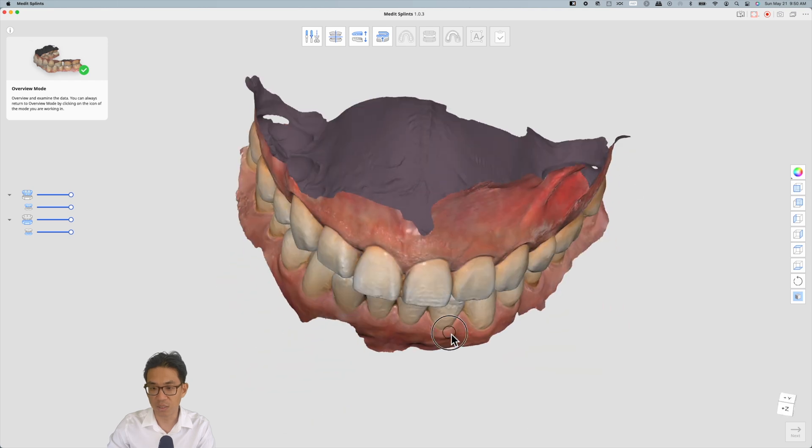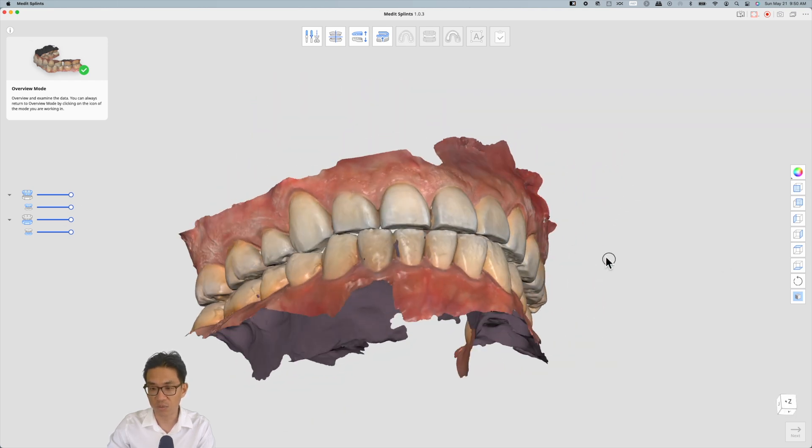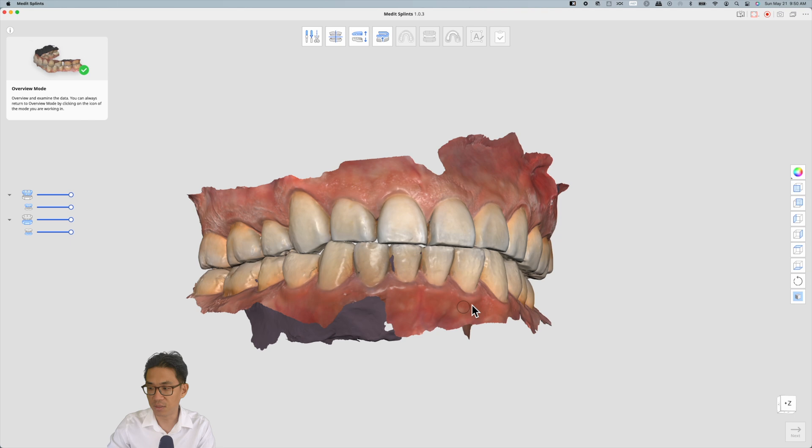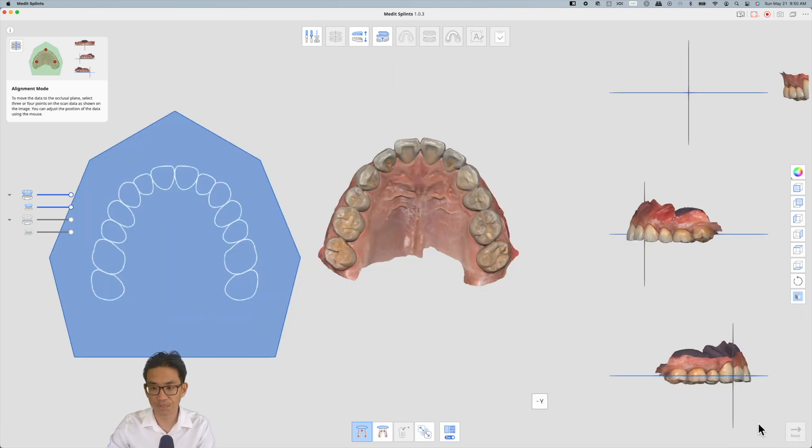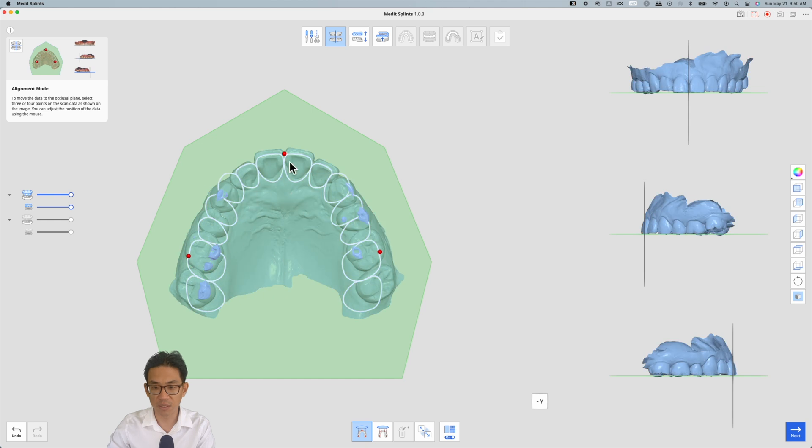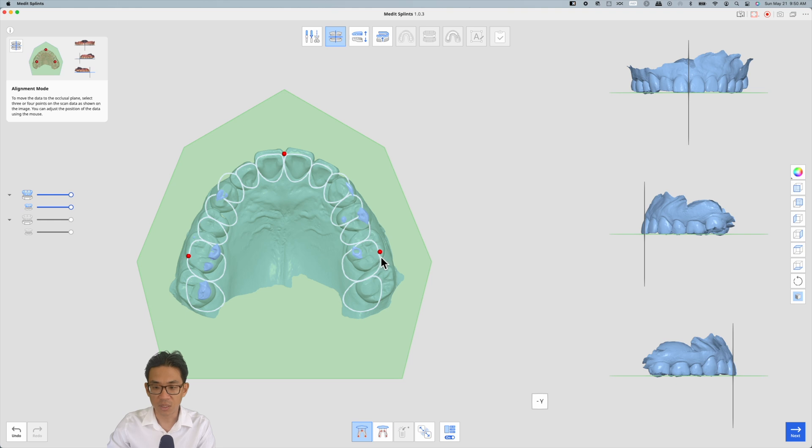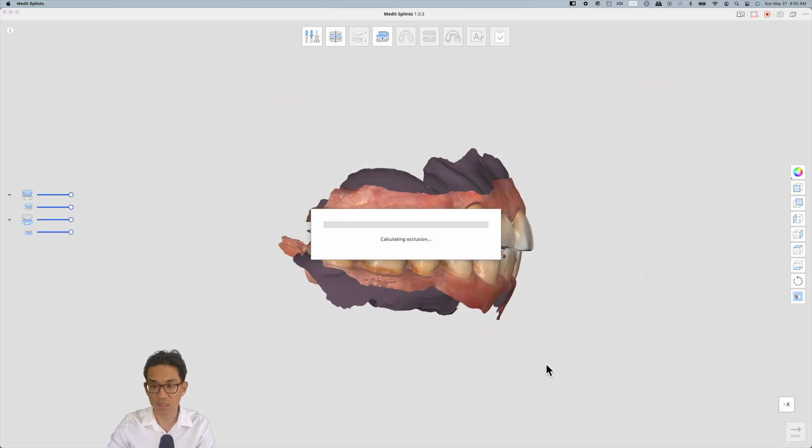Because we're not making models or anything like that, there's no real need to trim the data unless it's interfering with the teeth. I hit next and it automatically aligns, finding the midline, incisal edge, as well as the distal buccal cusp tips of the sixes. This looks pretty good in terms of alignment.